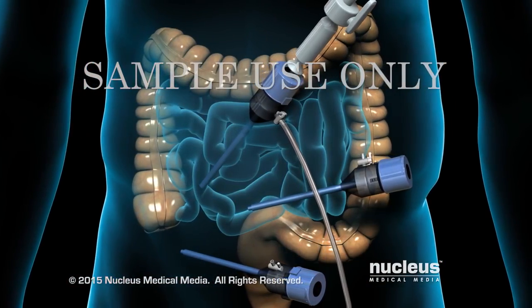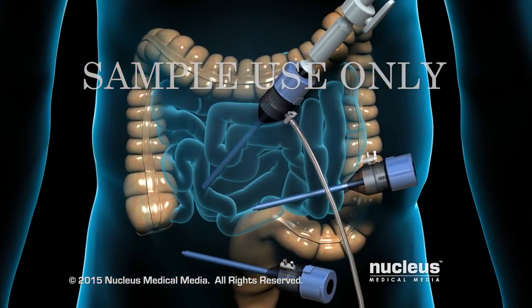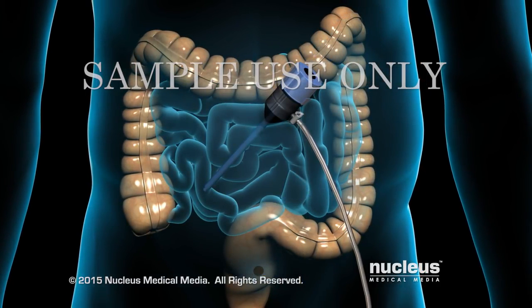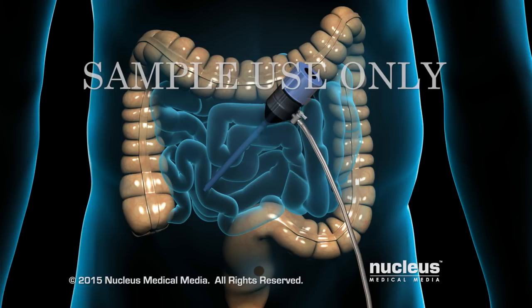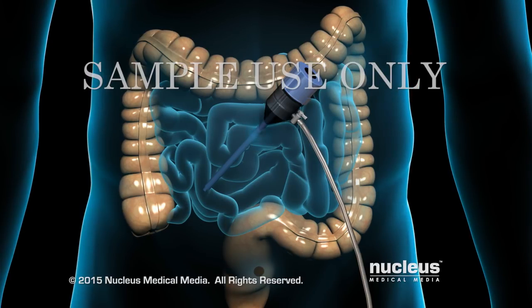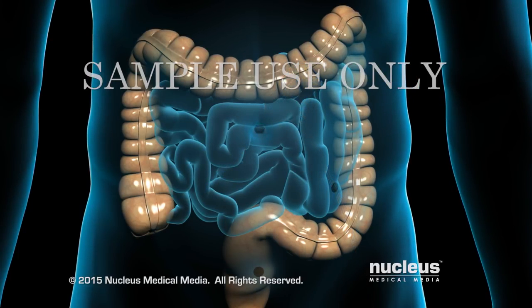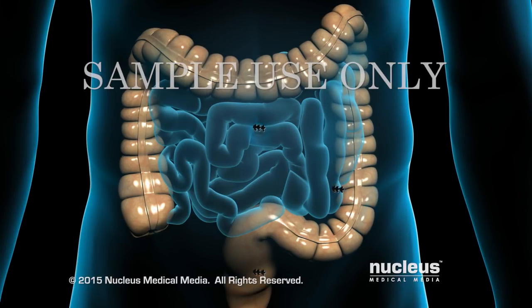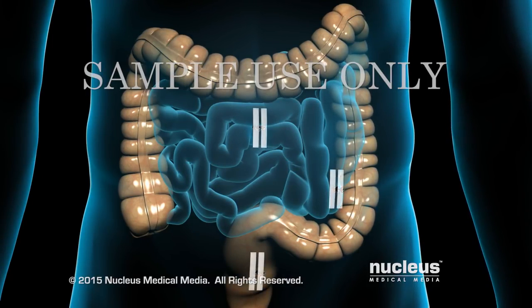At the end of the procedure, the laparoscope and surgical instruments will be removed. A port valve will be left in place briefly to allow the gas to escape from the abdomen. The incisions will be closed with sutures, followed by skin glue or skin closure tape.